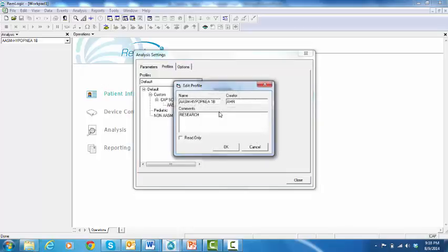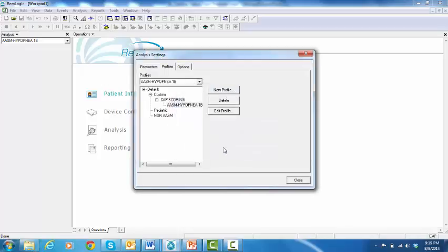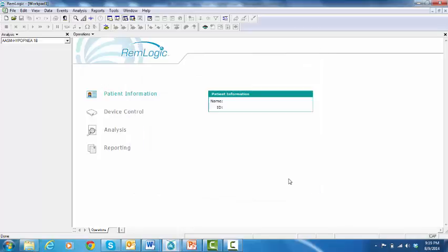on Edit Profile. In the dialog box that displays, change the profile name and other information if needed, and select Read Only to make the parameters non-editable. Then click OK, click OK, and click Close. Creating and modifying an analysis profile is finalized.